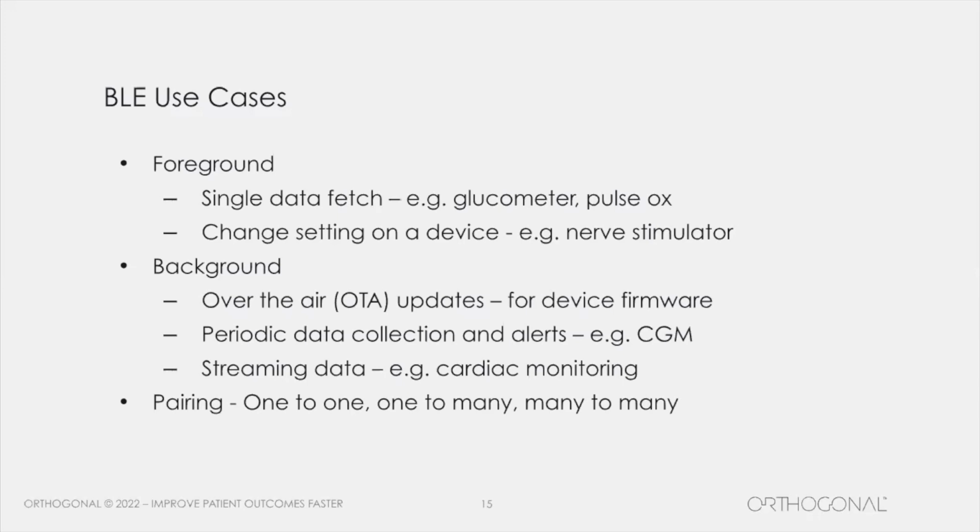So there are a bunch of things and usability issues you want to think about when you have that. How do you know you have the right one for the right person, or an insulin pump for that matter? There's risk in those cases.